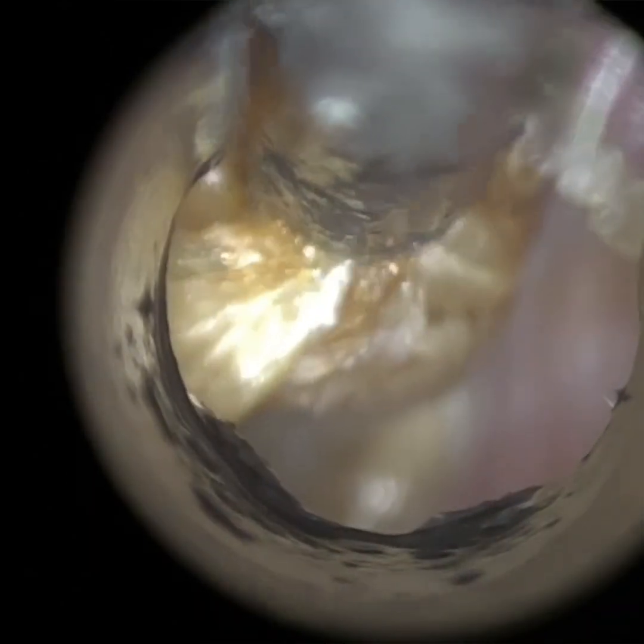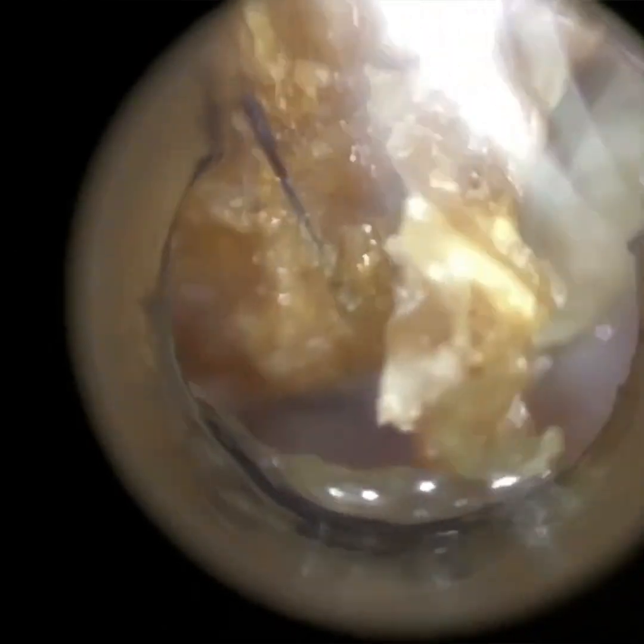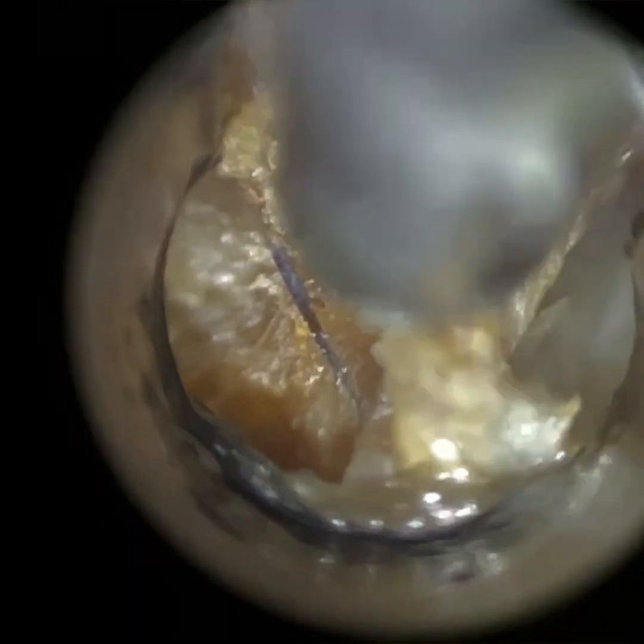However, for all the benefits of endoscopic earwax removal, a lot of people unfortunately do struggle to use an endoscope, for two reasons. The first is that when you use an endoscope, you don't use a speculum. A speculum is a hollow funnelled object — the end that goes into the ear is narrower, and the lateral end outside the ear is wider. It's used to straighten and dilate the ear canal. Without it, it's reliant upon the specialist using the endoscope itself to stretch and dilate the ear.